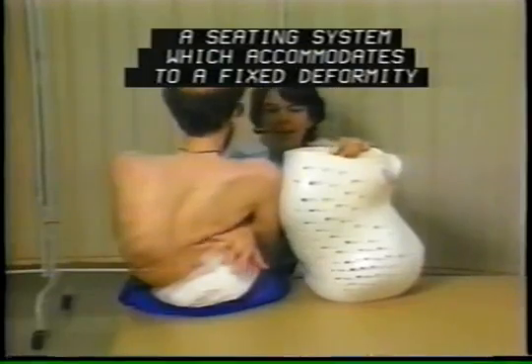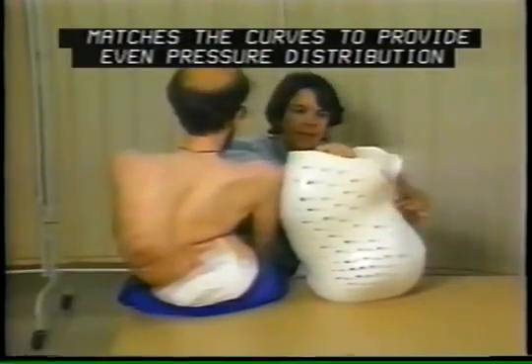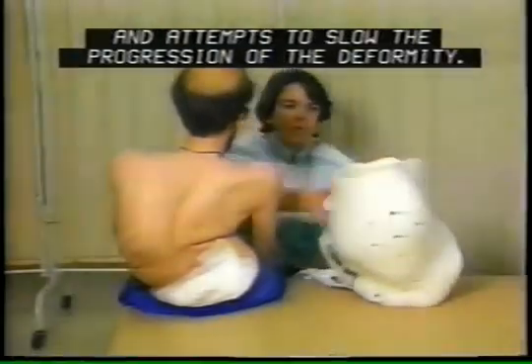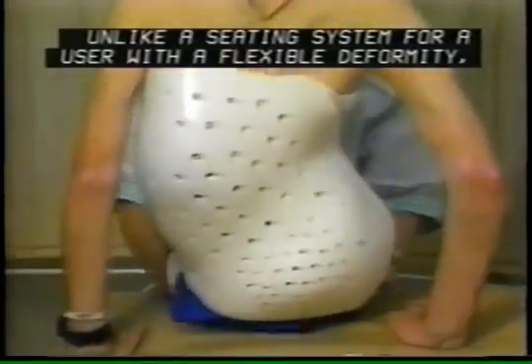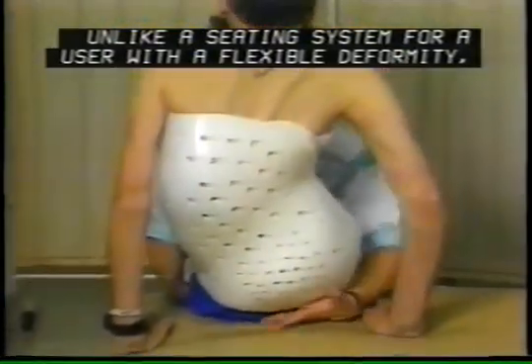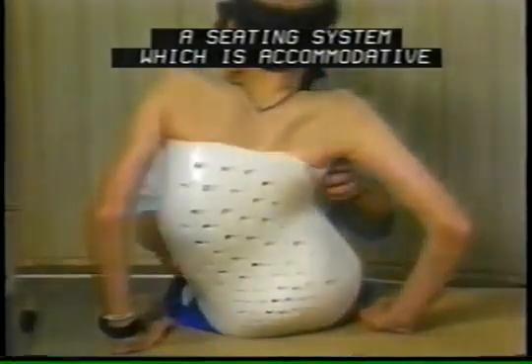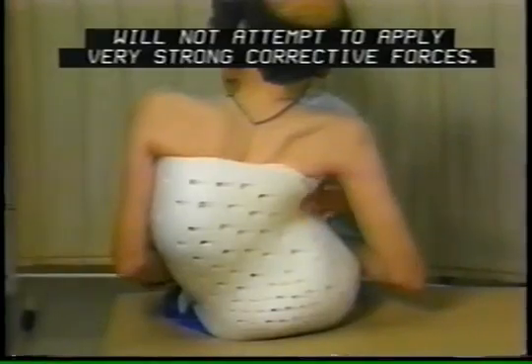A seating system which accommodates a fixed deformity matches the curves to provide even pressure distribution and attempts to slow the progression of the deformity. Unlike a seating system for a user with a flexible deformity, a seating system which is accommodative will not attempt to apply very strong corrective forces.